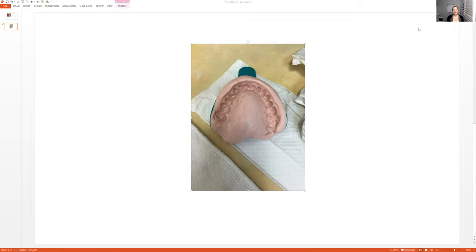That's if the dental assistant is sick, or there's just no time, or I pretty much have to take them, right? But this is what the perfect alginate impression needs to look like.